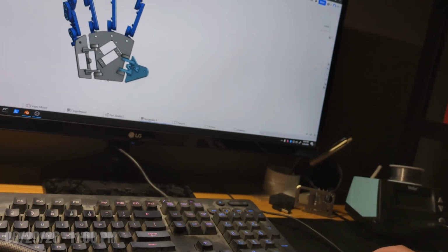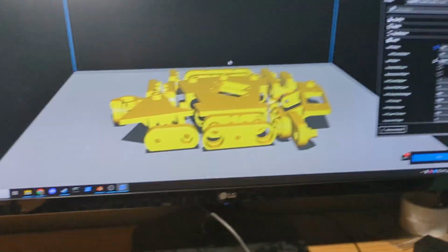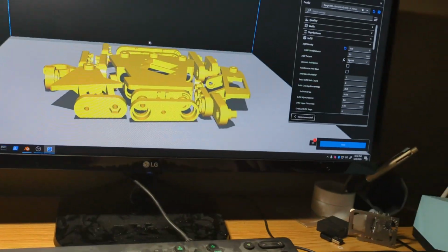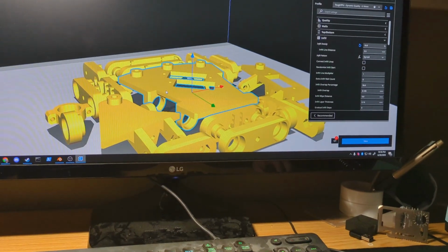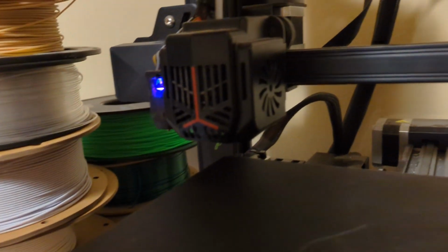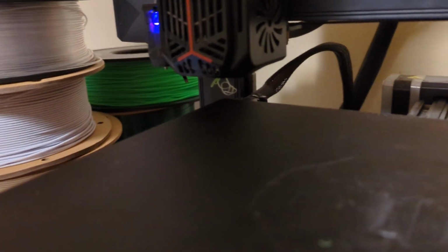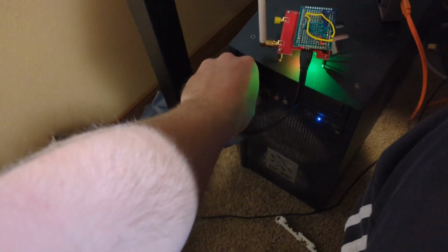Alright, so hopping into Onshape, export the whole entire studio as individual parts, download it, extract it, whatever. Bring it all into Cura, a slicing program, and I go ahead and orient all the parts. And from here, I hit go on the slicer. Now I go to the printer, clean off the bed, and preheat the PLA so I can remove the old filament. Insert the new filament, and there it goes. Stuff's coming out. Good.